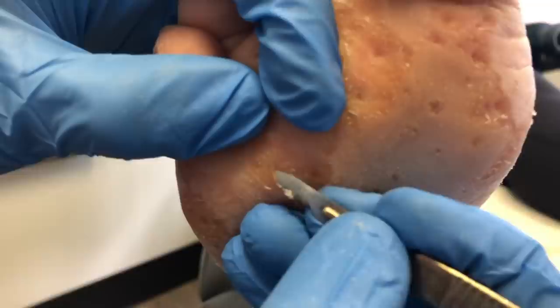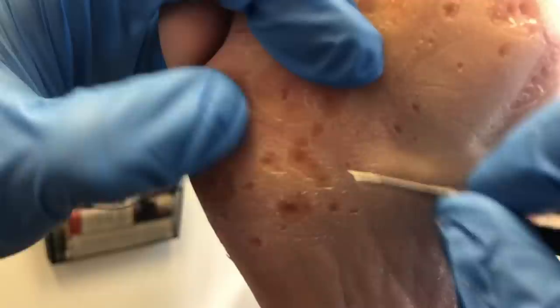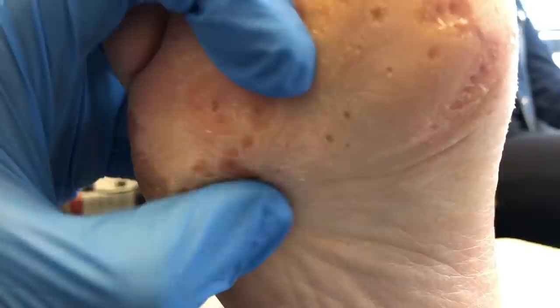Here I've switched to a pencil grip approach, going almost straight at the corn — this is called enucleation. I'm using the tip of the blade to really get the corn out. I'll do this on the bigger corns. You can also see I'm smoothing out the ridges with this smaller blade.